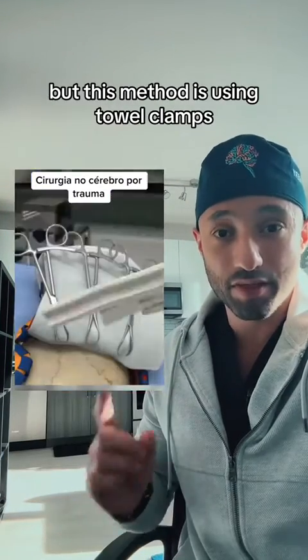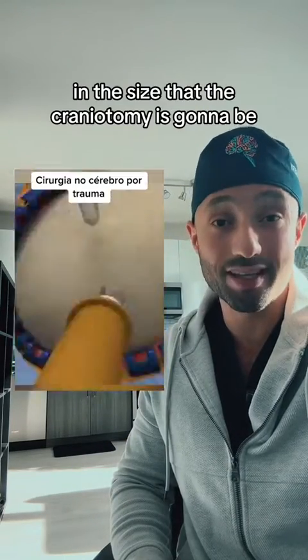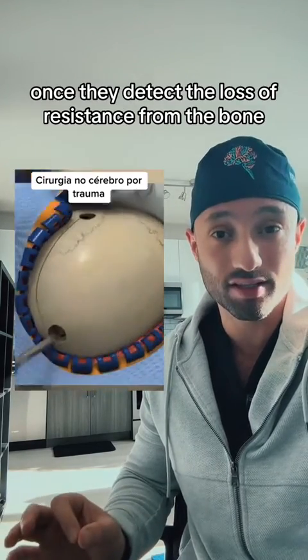There are different ways to keep the scalp down, but this method is using towel clamps. We then use a high-speed drill to create burr holes in the size that the craniotomy is going to be. A fun fact about these drills: they actually stop automatically once they detect the loss of resistance from the bone.